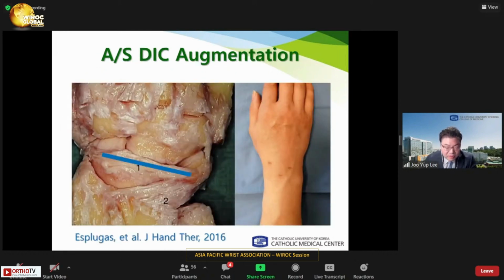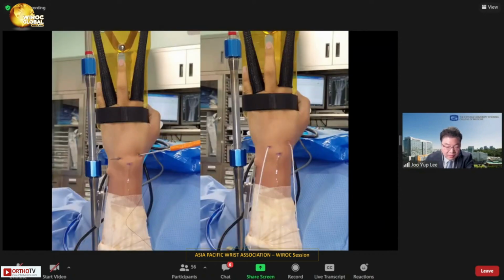Once the carpal bone was reduced with axial traction, I decided to put a non-absorbable suture alongside the dorsal scaphotriquetral ligament via the STT and MCU portals to fix the suture to the scaphoid and triquetrum with 2 anchors. Here is an example of passing suture tape with a microsuture lasso.